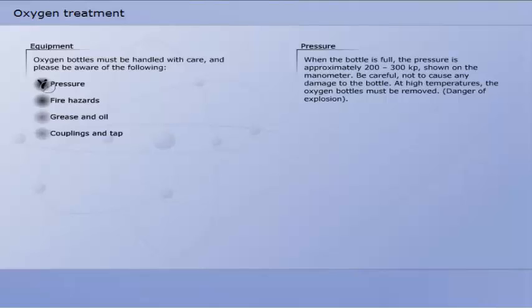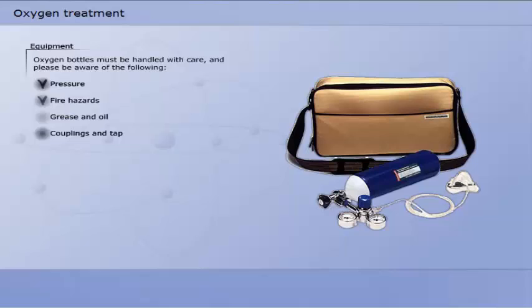When the bottle is full, the pressure is approximately 200 to 300 kp, shown on the manometer. Be careful not to cause any damage to the bottle. At high temperatures the oxygen bottles must be removed.